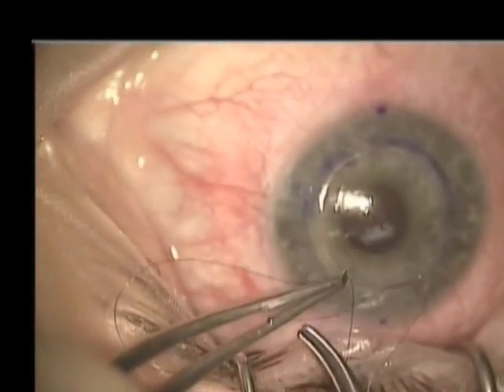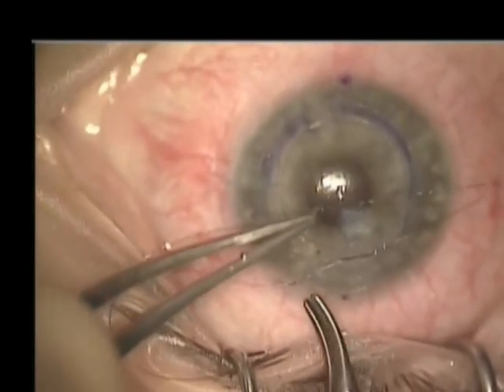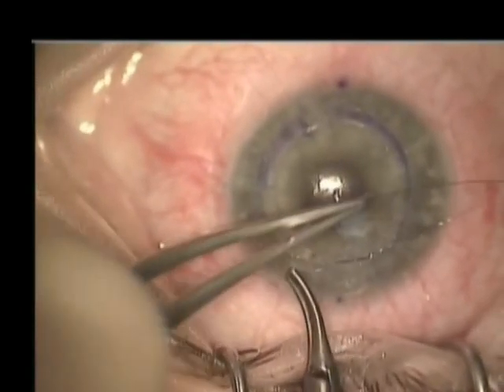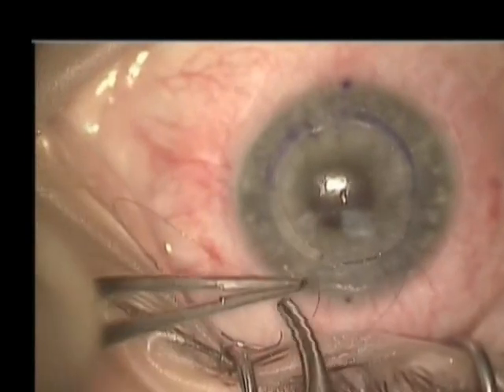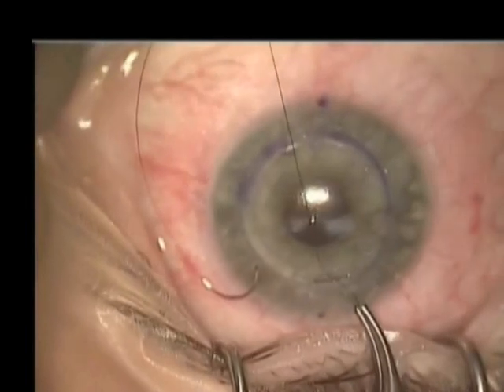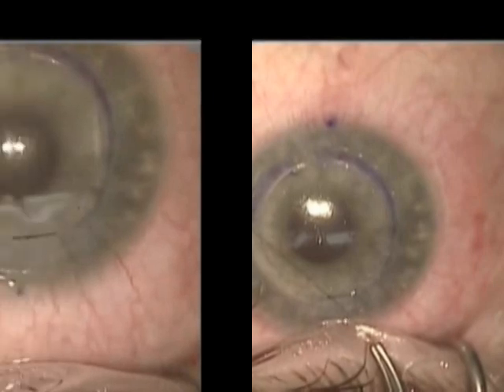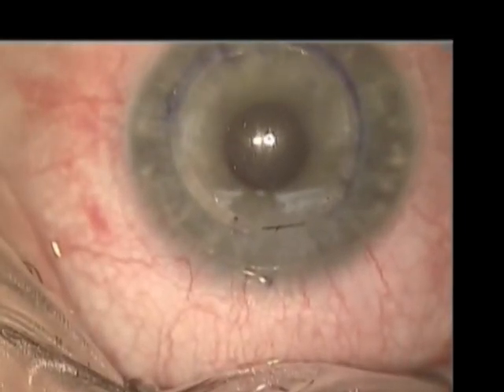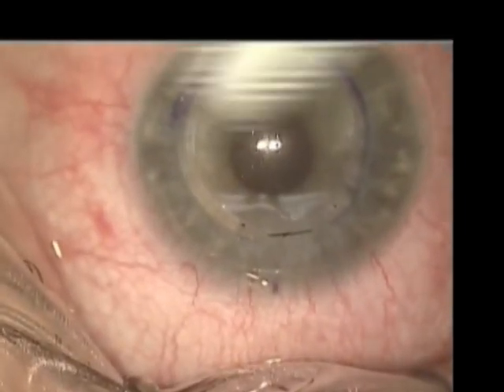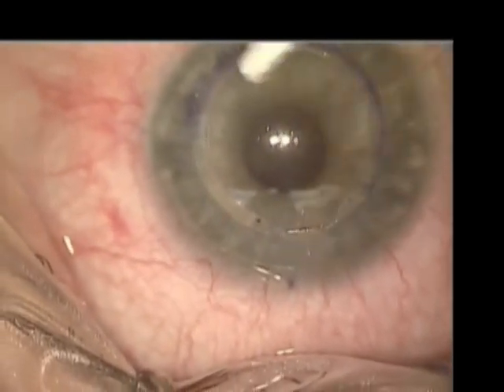The incision is then sutured with a single interrupted 10-0 nylon suture, and the suture is tightened to prevent fish-mouthing of the incision. And that concludes the case.